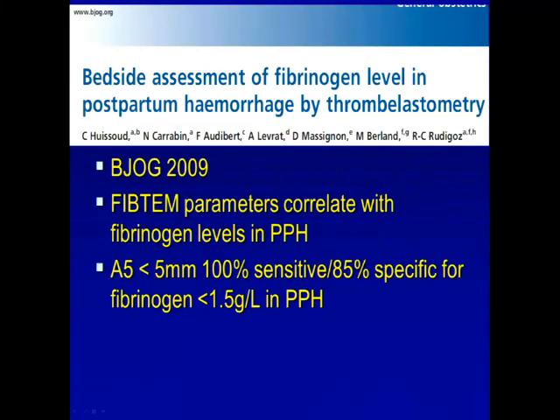From a cold start, you should be able to run a sample within a handful of minutes. You do have to warm up the reagents from the fridge. That takes a handful of minutes. And you just have to unplug the machine from the wall temporarily until we get the second machine sorted out in the lab, which we need to, and then wheel it over to theater 6.